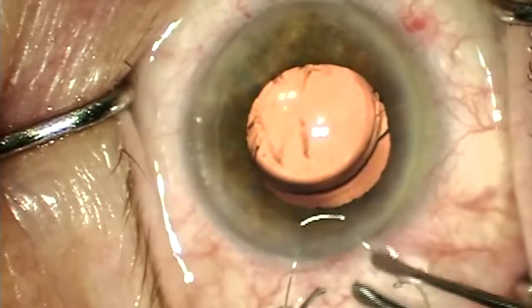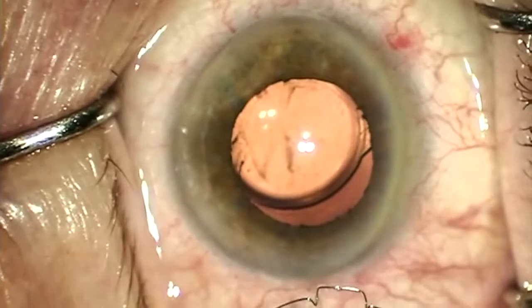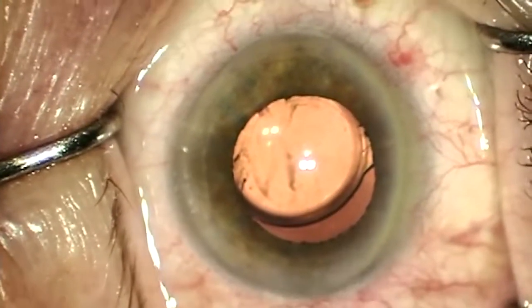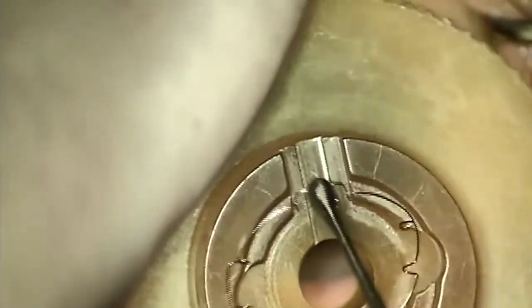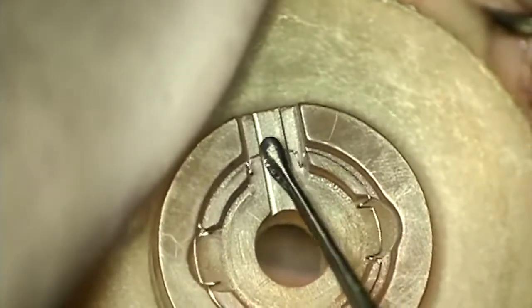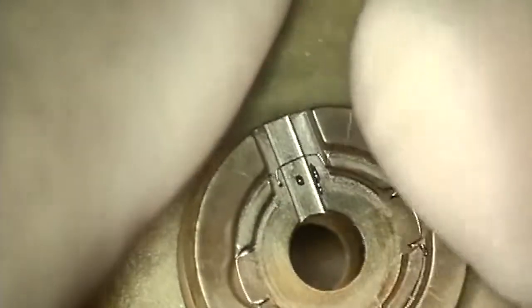Once the ring is out, I'm very careful not to place any springing forces on the ring. I back the microscope up, carefully place the ring back into the container, and make sure it is seated at the bottom. I do this under magnification. Occasionally, if the ring is crooked or not laying flat, I'll put my finger over the ring, pressing down and removing my finger with a rolling motion off to the side, visualizing the ring to ensure it is in fact in place and safely held.